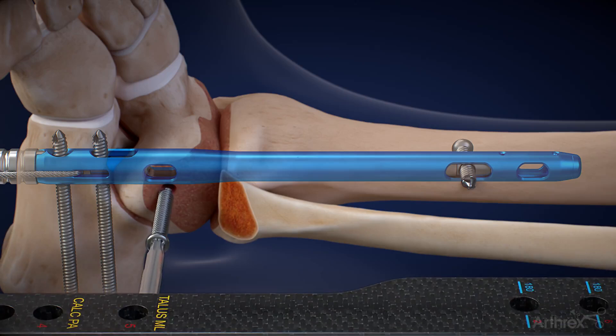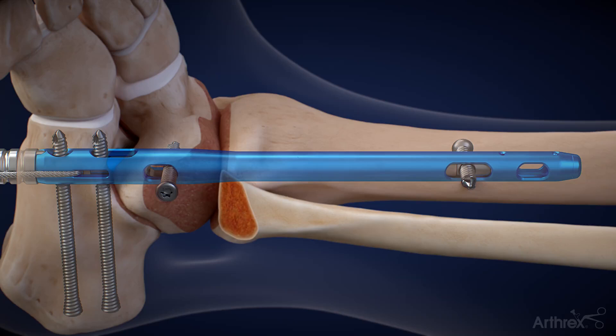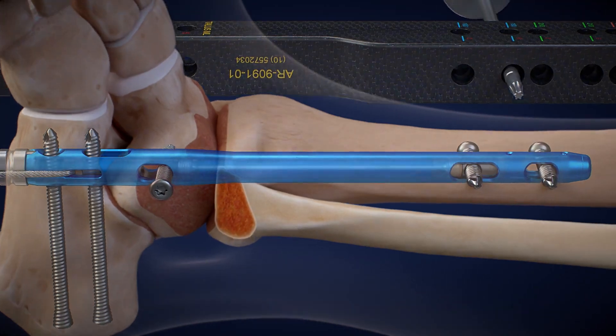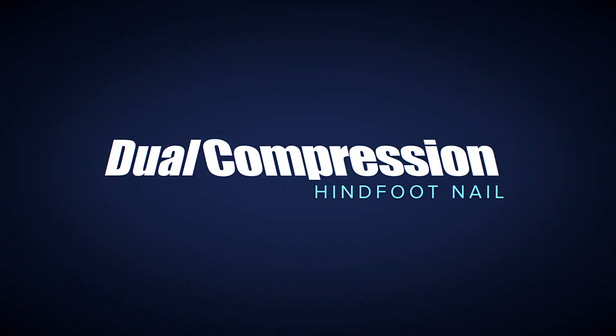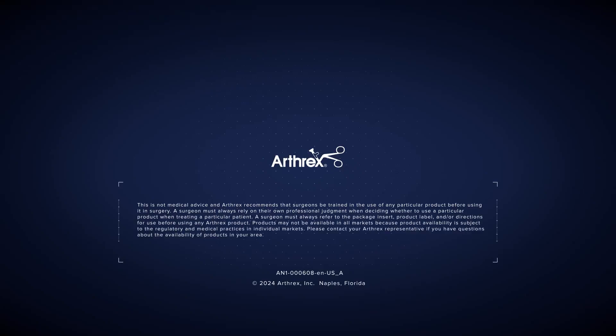An optional talar screw is then inserted to provide rotational stability of the talus. An optional second proximal tibial screw can be inserted for additional support proximally.